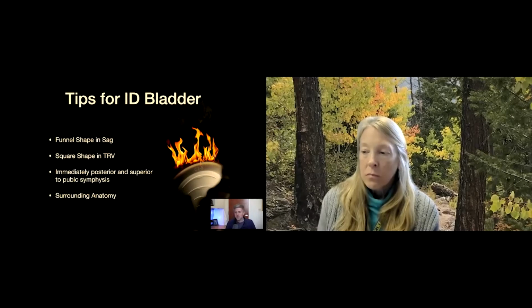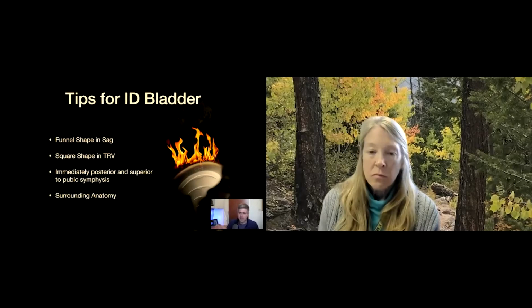And you can also confirm your findings by just looking at surrounding anatomy. Look at the things that are normally supposed to be there, and positively identify normal things.